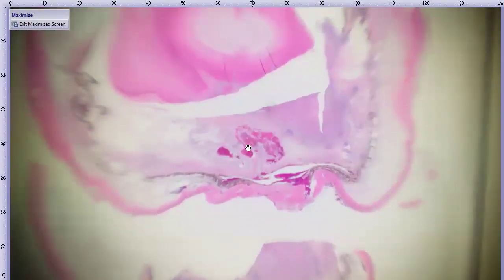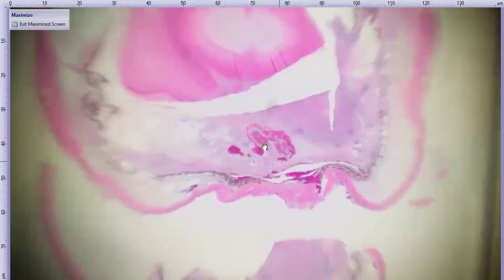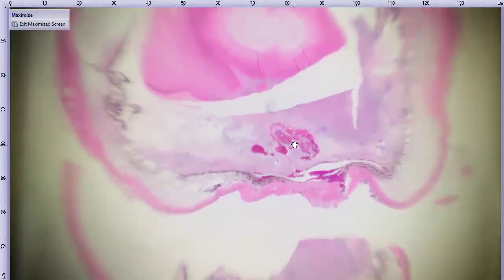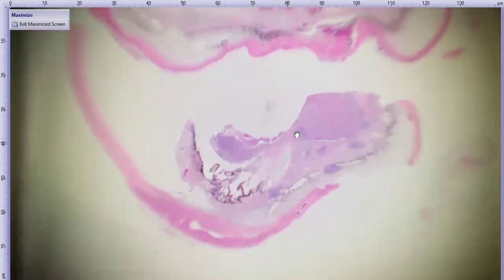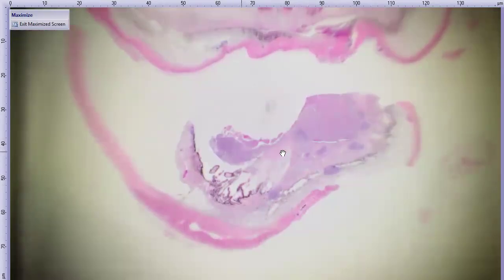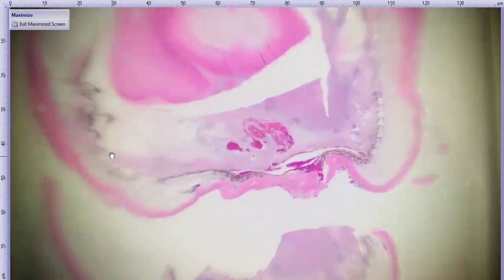We've got some hemorrhage, and this tissue here, which ends up being the detached retina that we'll take a closer look at. And then this is just an extra section of our globe to get a better look at more of that material that is in the vitreous and the posterior chamber. Oh, and then we can also see the scleral wrinkling to go along with the phthisis bulbi.